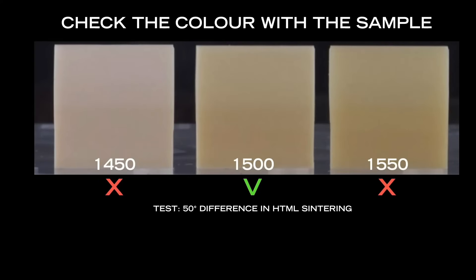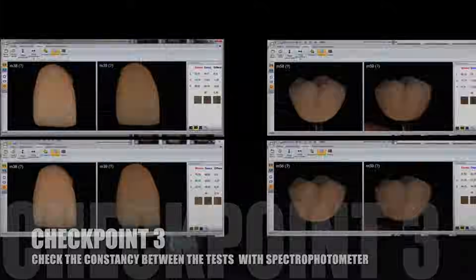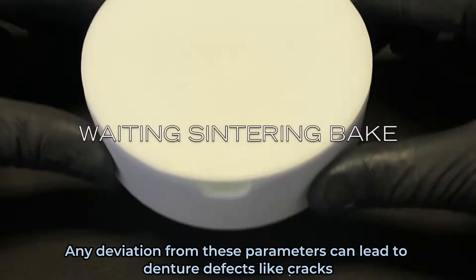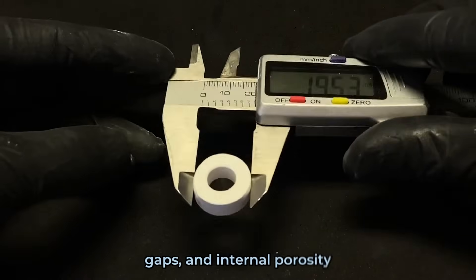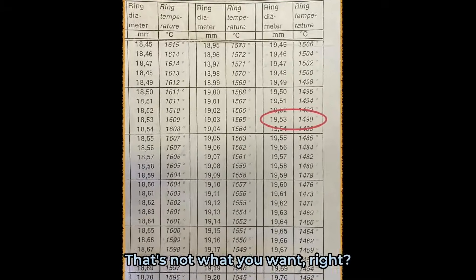Last but not least, we've got improper sintering — time, temperature, and cooling rates. You gotta control them like a boss during sintering. Any deviation from these parameters can lead to denture defects like cracks, deformations, gaps, and internal porosity. That's not what you want.